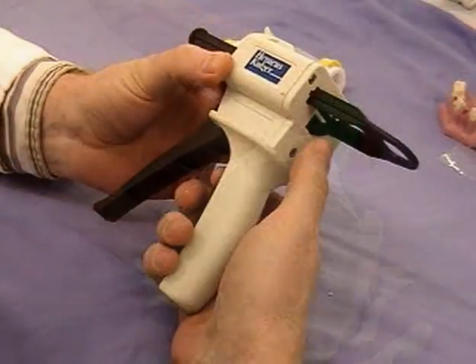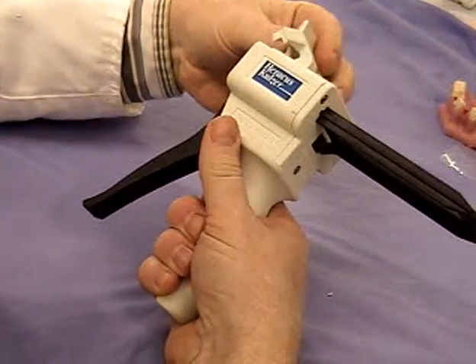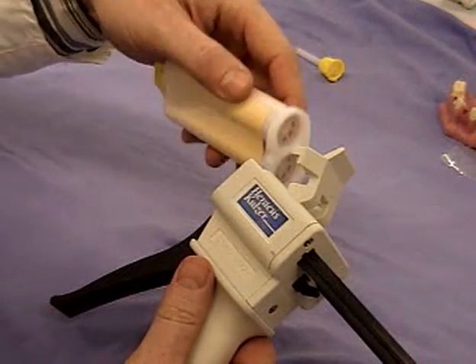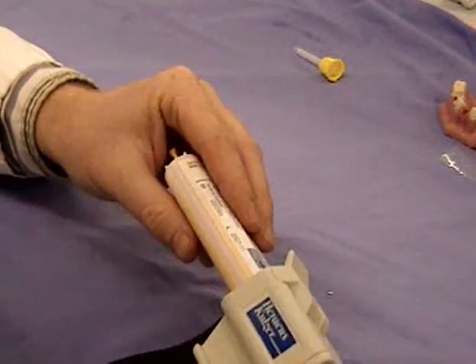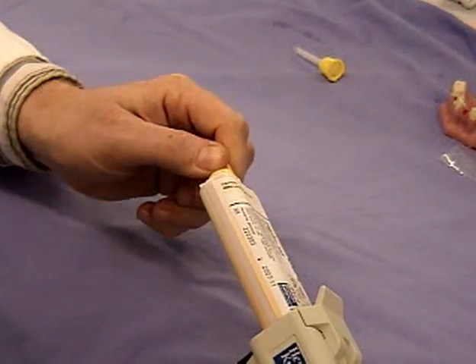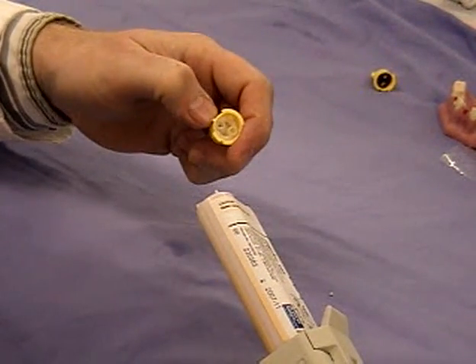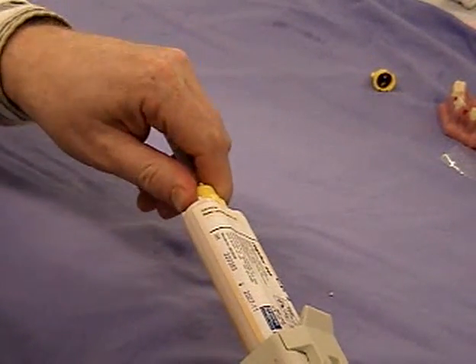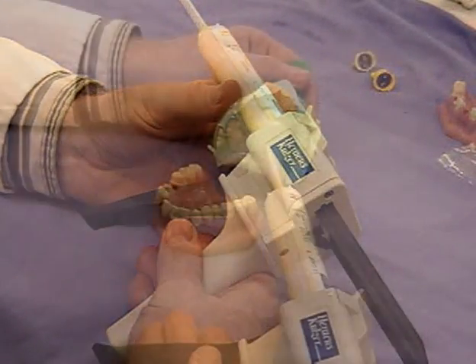The reason we don't just use the light-bodied material is because we'd get too much contraction as it sets. This is the gun for the application of the silicone. You can see the cartridge for the light-bodied silicone being placed into the gun — it's got a locating notch, so if you're forcing it, you're doing it wrong. The end cap comes off and there are two little nozzles on the end for the two components, and then there's a disposable mixing nozzle that goes on the same way. You can then prime the gun by squeezing it a few times to get it ready.